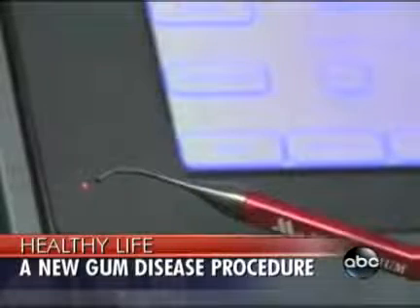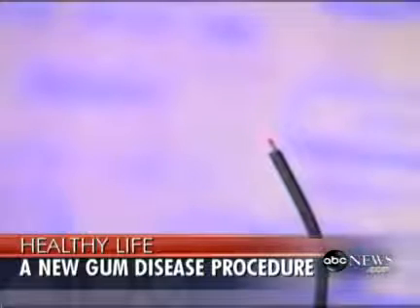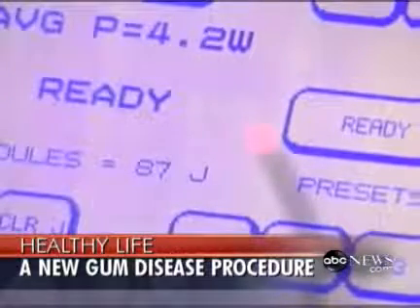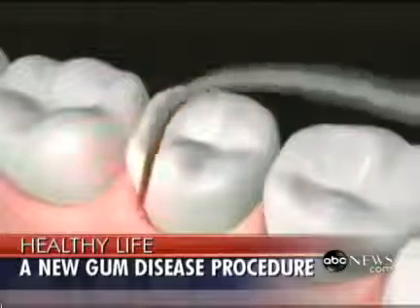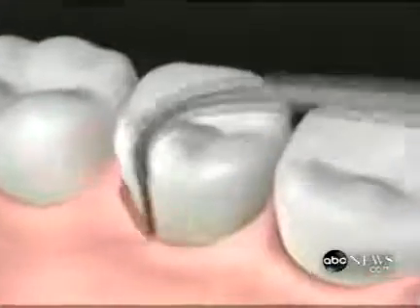Laser-assisted new attachment procedure, also known as LANAP, is a means to treat gum disease using a laser versus scalpel and suture surgery. After a proper periodontal diagnosis with x-rays and periodontal chartings, we use the laser to gently pass between the gums. It's a very tiny fiber optic, about 3 human hairs, to vaporize the disease and leave the otherwise healthy tissue structures in place. We use ultrasonic root debridement, root cleaning devices to clean the root surface, and then we use another setting on the laser to clot the blood so that we get a seal, so we don't have to use sutures. About half of the mouth is treated at a given point in time, and then 1 week later the other half is treated.